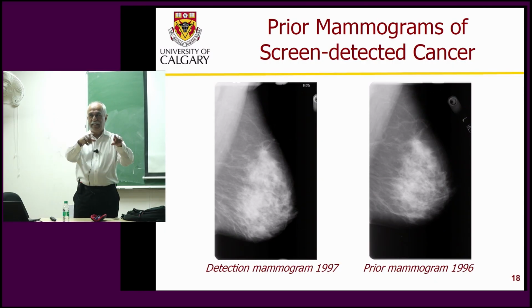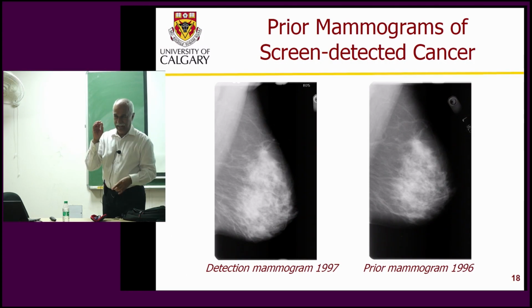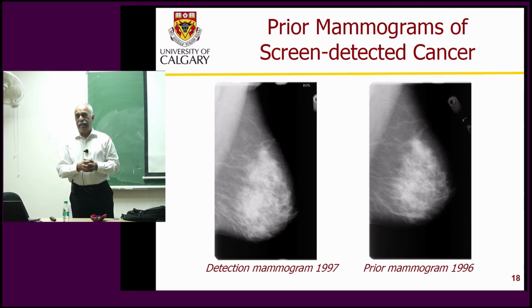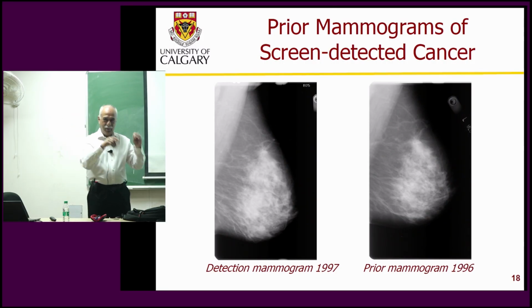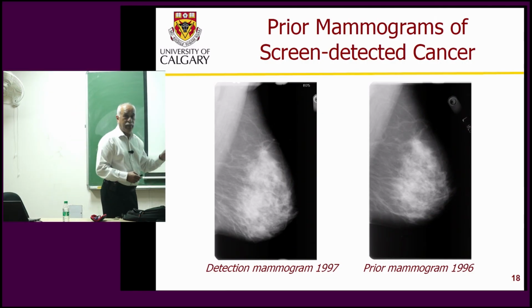I'm not allowed inside, and I cannot even touch the folders containing films or anything. When these images were digitized in our lab using a high-resolution laser scanner mounted on an air-suspended table, a member from the screening program came, and one of my students sat with her, and they digitized the films, and in the evening she would take them back and put them in the screening program. So these are some of those images that were digitized.